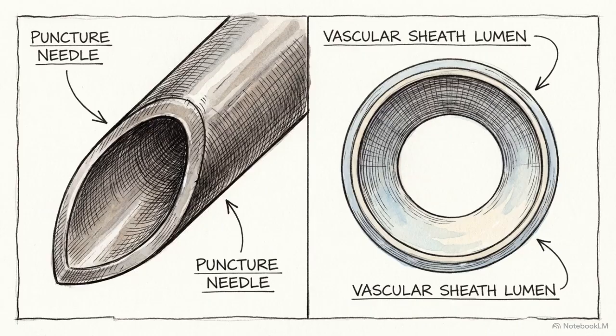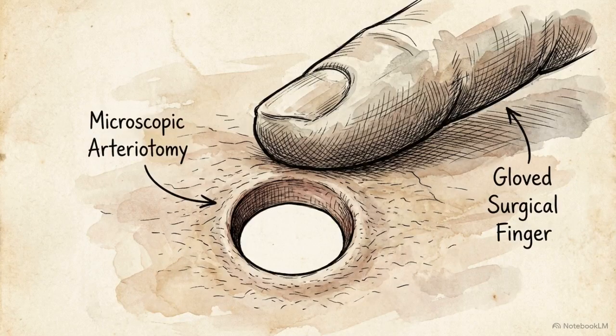Mastering the coaxial system requires tracking the shifting definitions of size, from outer gauge to inner French capacity, to accurately engineer the access site and ensure patient safety.